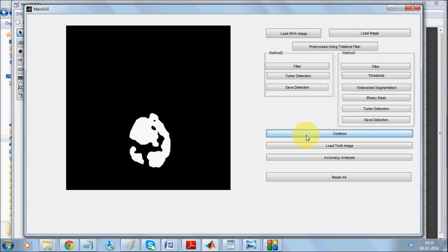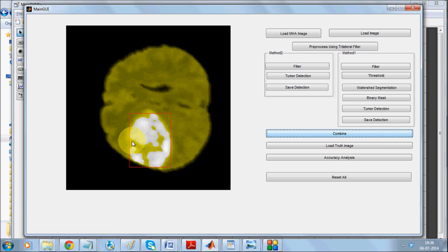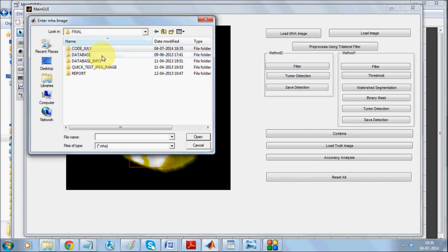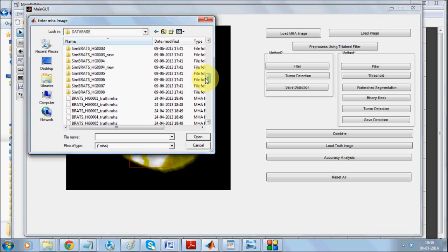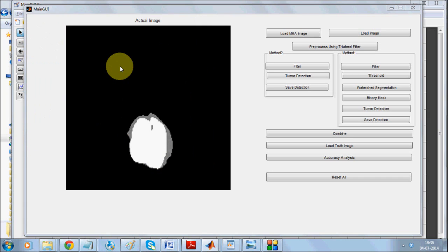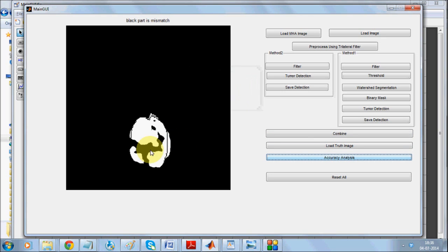Now we'll be combining both methods. After combination it detects the whole area. The EM method detected a certain part, this detected certain part. Now let us load the truth image. This is the fourth image. This was the actual area being detected. Just check out the accuracy analysis. That's about 98 percent. This is the area that is constant and this is the part which has not been detected.